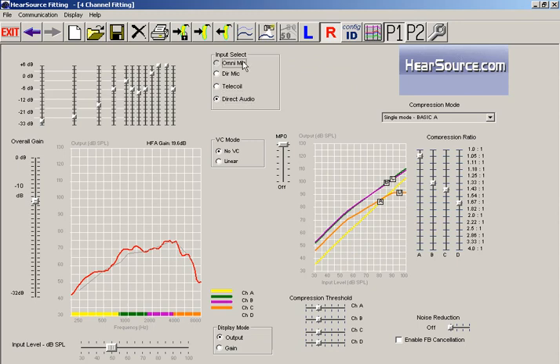Now the most common option that people use is the Omni microphone system. This is well suited for most of the situations in your life. What Omni microphone does, it uses one microphone to pick up sounds 360 degrees equally. And so in those quiet environments at home when you're trying to track a couple sounds in the environment such as watching TV while somebody's talking to you either from behind you or off to the side, the Omni microphone system will pick that up very well for you.